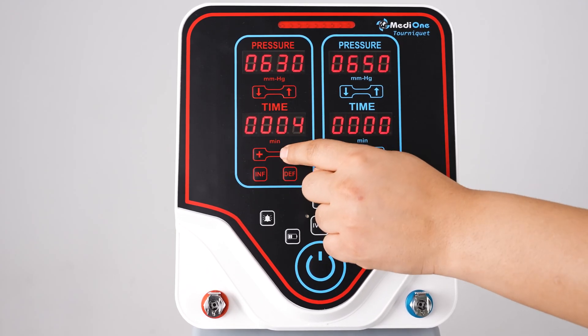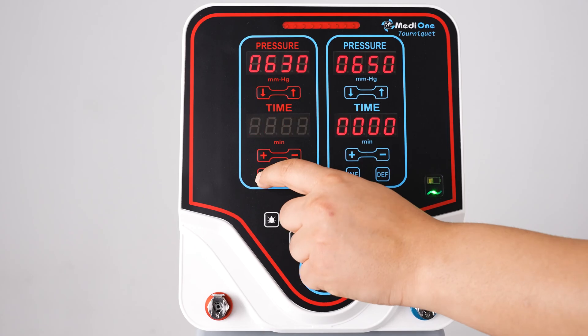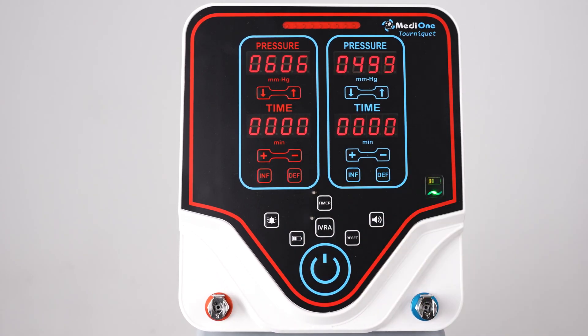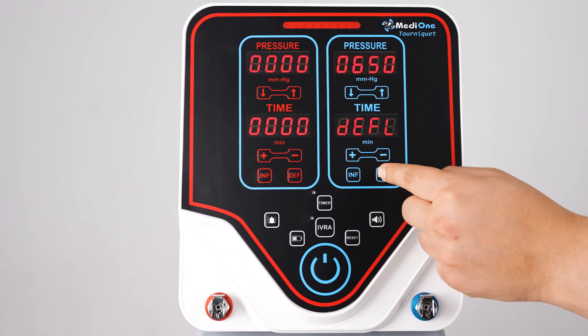For safety reasons, the device does not automatically deflate the cuffs even if the time you set has elapsed. To inflate the cuffs, press the inflate button two times. To deflate the cuffs, press the deflate button two times.